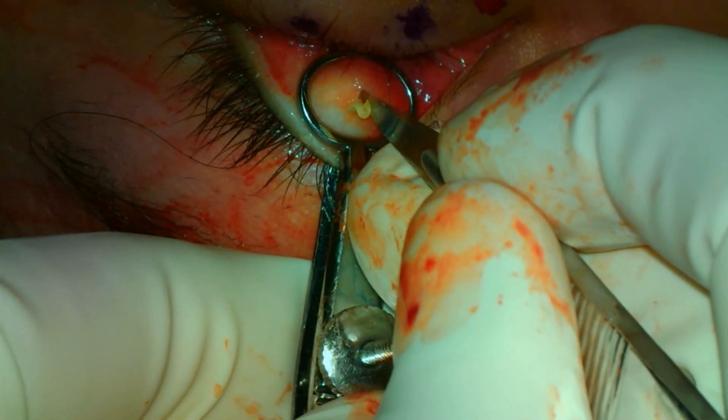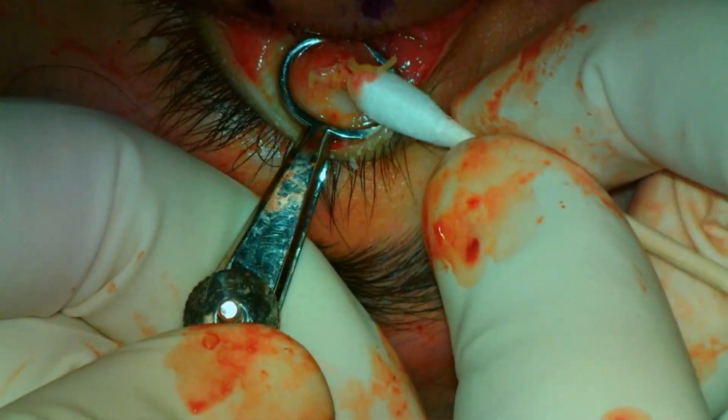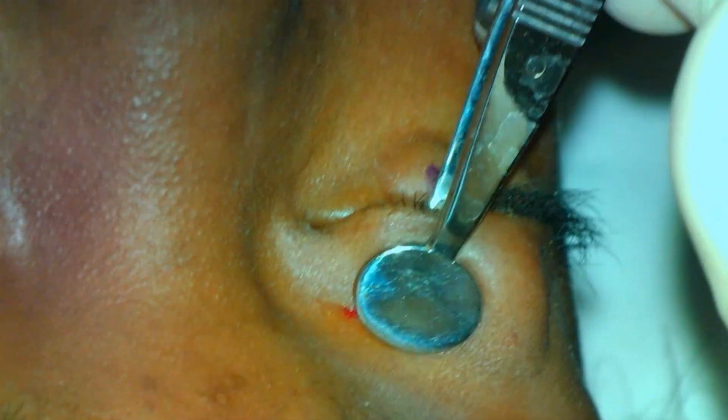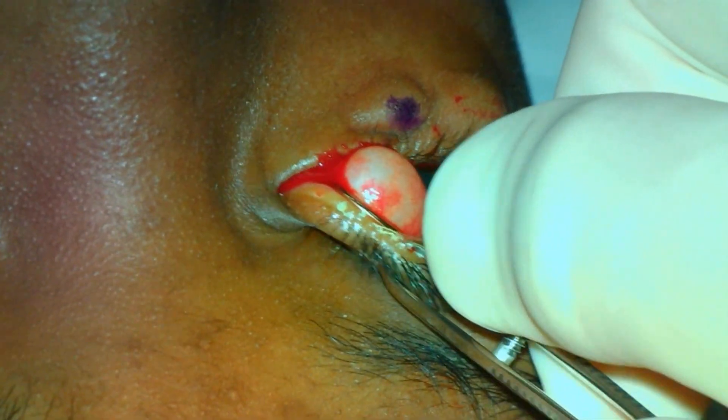Another upper eyelid chalazion with expression of the thick contents. The chalazion clamp is placed and the associated meibomian gland disease is demonstrated.